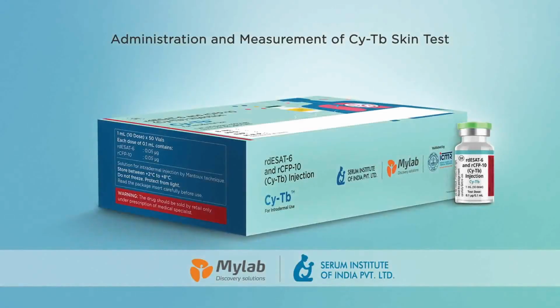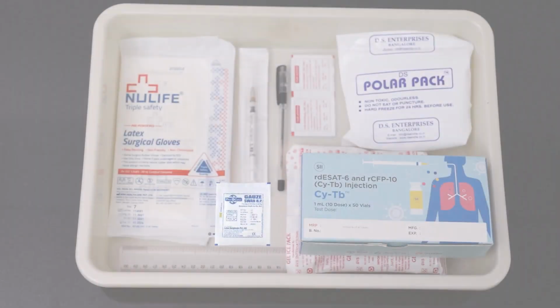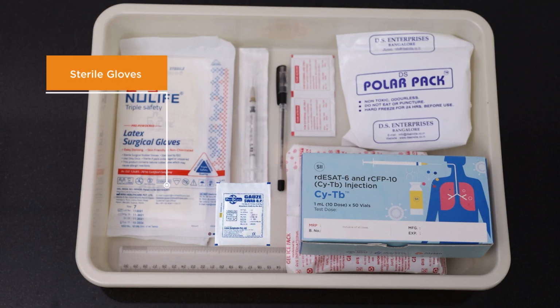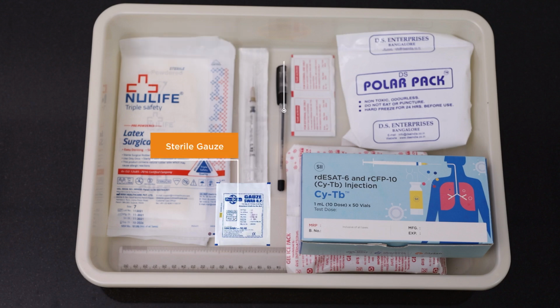We will be demonstrating administration and measurement of CyTb skin test. Explain the procedure and take the required consent. Material needed for the procedure are a 10-dose vial of CyTb, sterile gloves, alcohol pads or spirit, 1 ml graduated disposable syringe, 26 gauge needle or suitable needle for intradermal injection, sterile gauze, ballpoint pen and a scale for measurement.